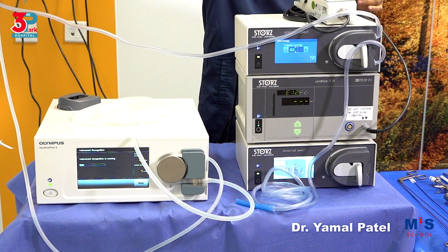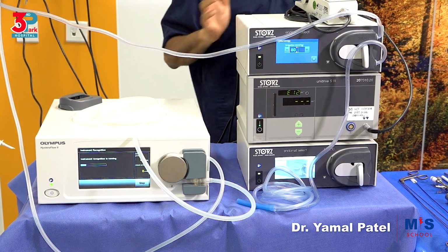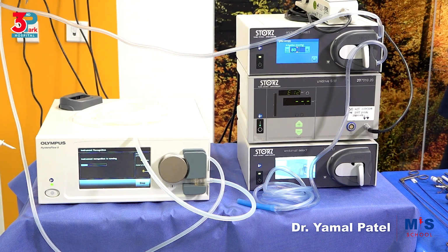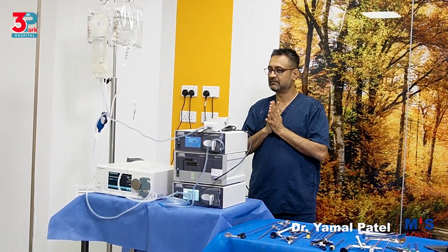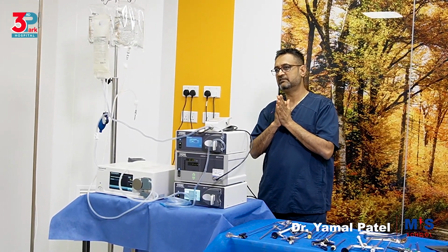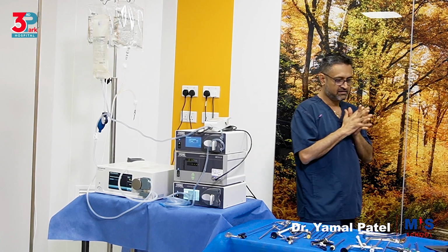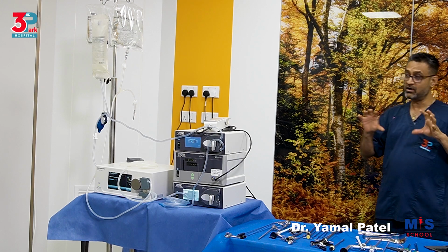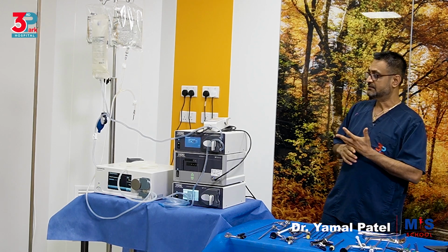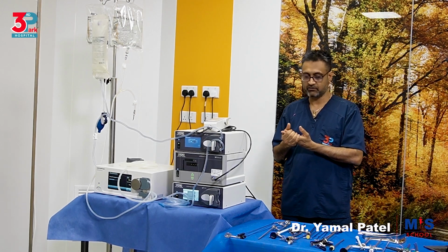So preset maximum intrauterine pressure is the most important among these, and the guide to it should be the mean arterial pressure, the MAP. The mean arterial pressure is actually the average arterial pressure throughout one cardiac cycle, systole and diastole included.